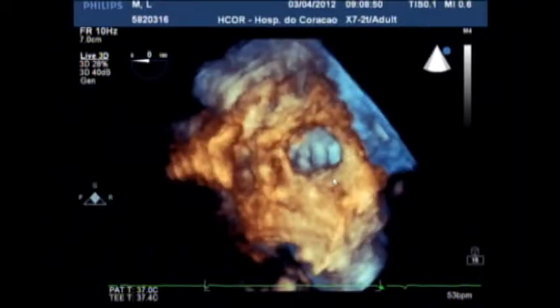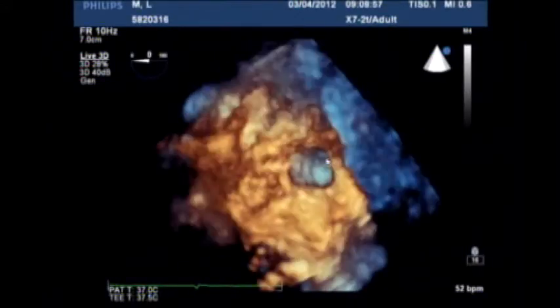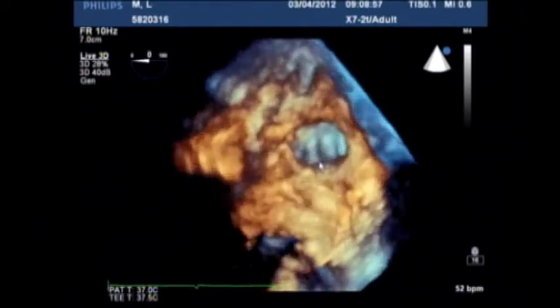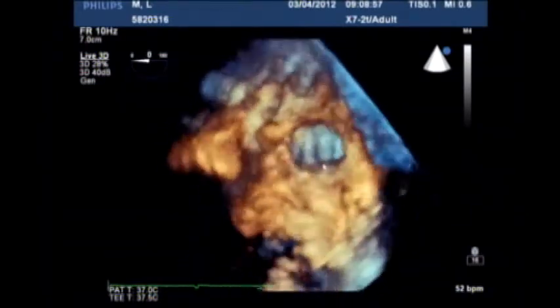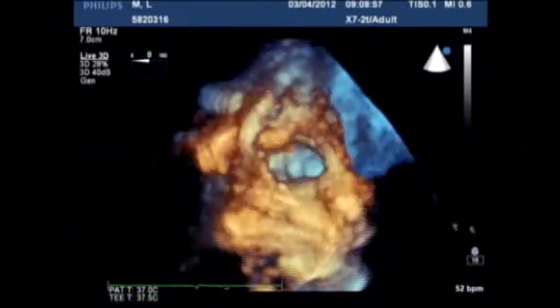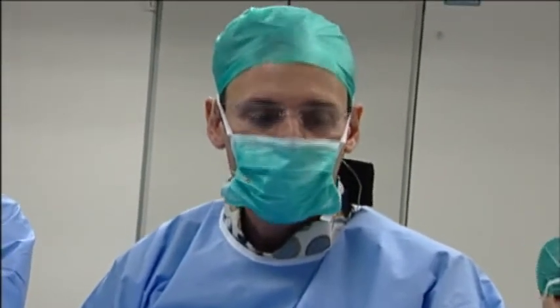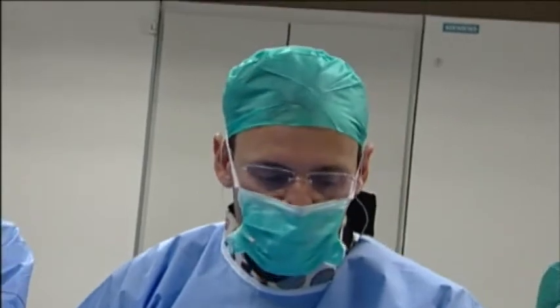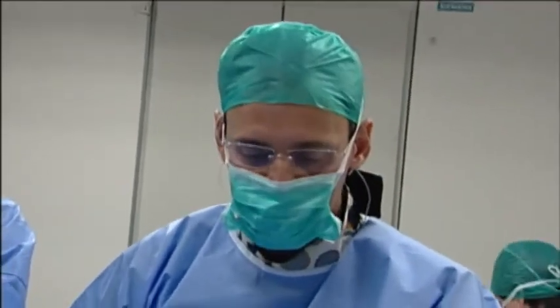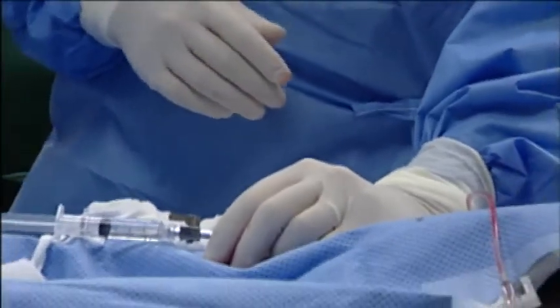Just to let you see here, we have the 3D pictures, and we can see down there that we have these multilobes, but they are distal, and this is the mouth of the left atrial appendage. So we are ready to go transeptal. We are using a Swartz long sheath from St. Jude and a regular needle for transeptal.